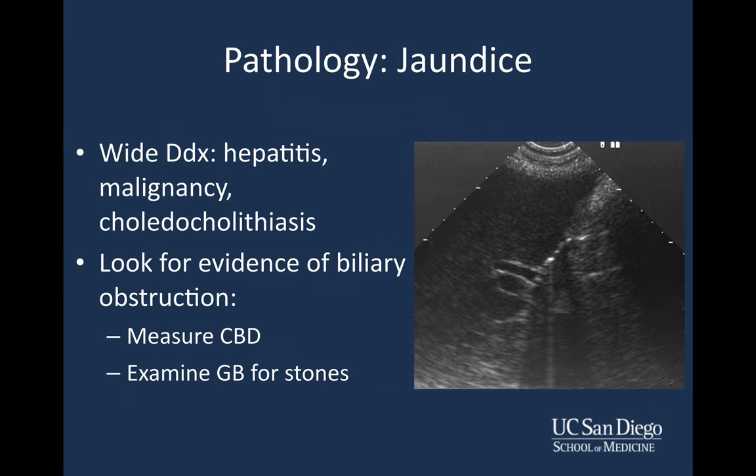Now, other patients may not have abdominal pain at all. They may have other presenting symptoms in your emergency department. If someone presents with jaundice, obviously that has a wide differential diagnosis. They could have hepatitis, they could have a pancreatic malignancy, but they could also have choledocholithiasis.